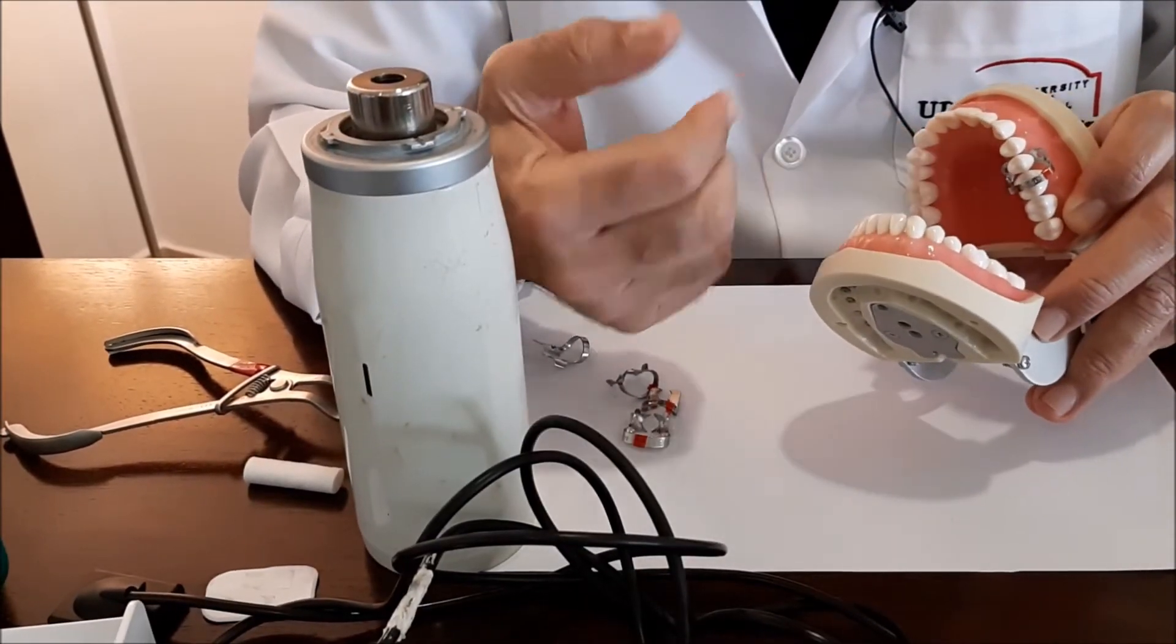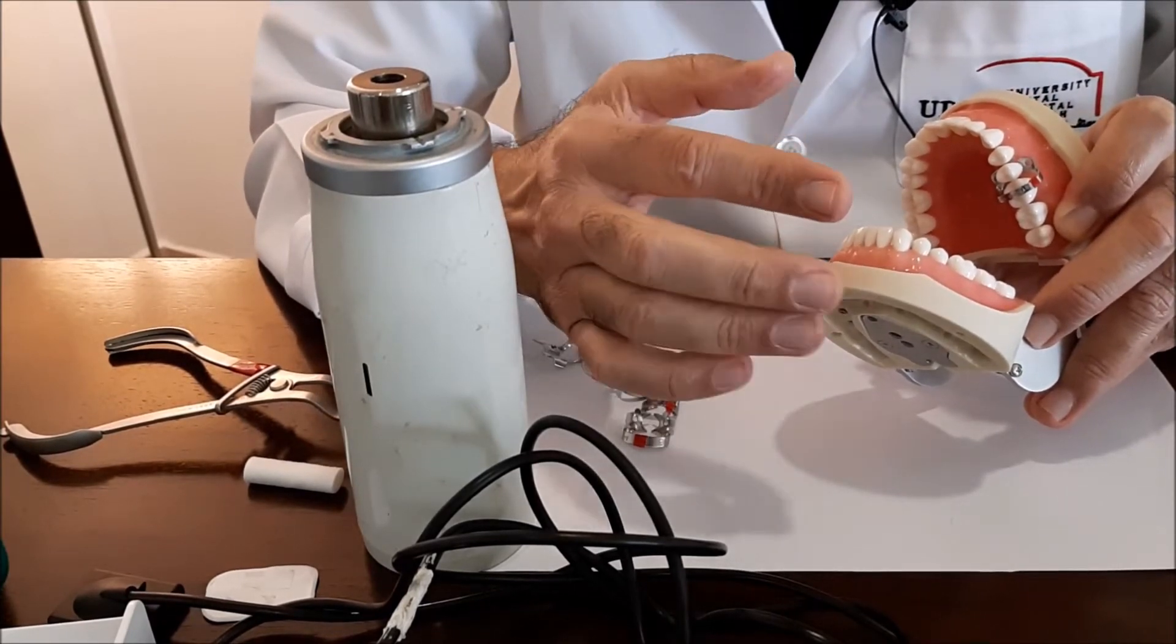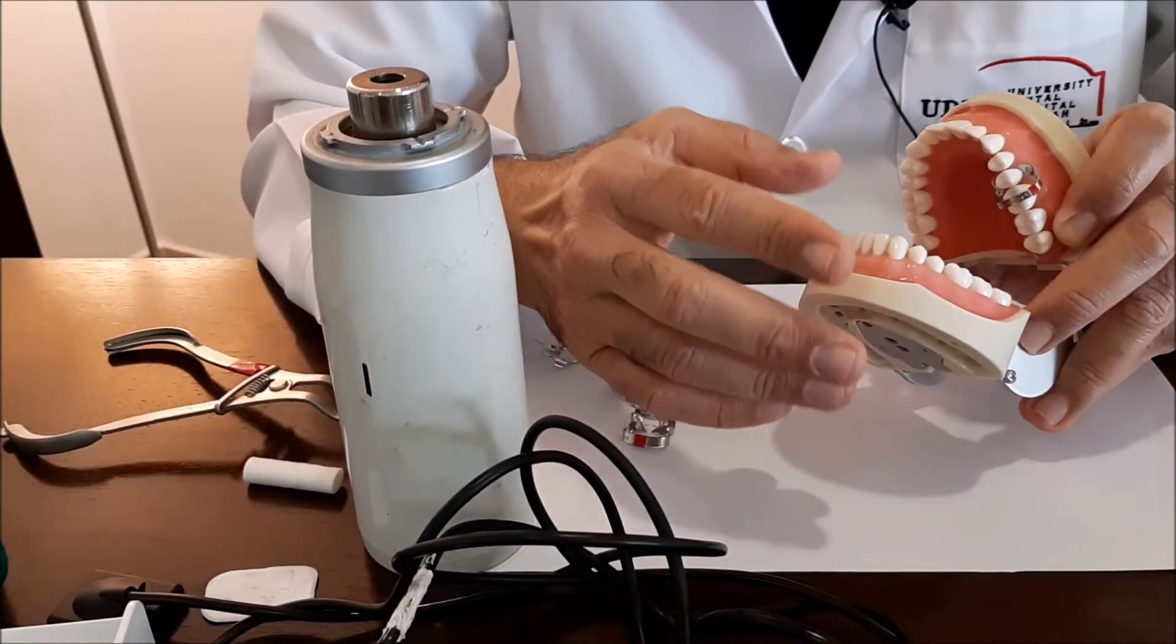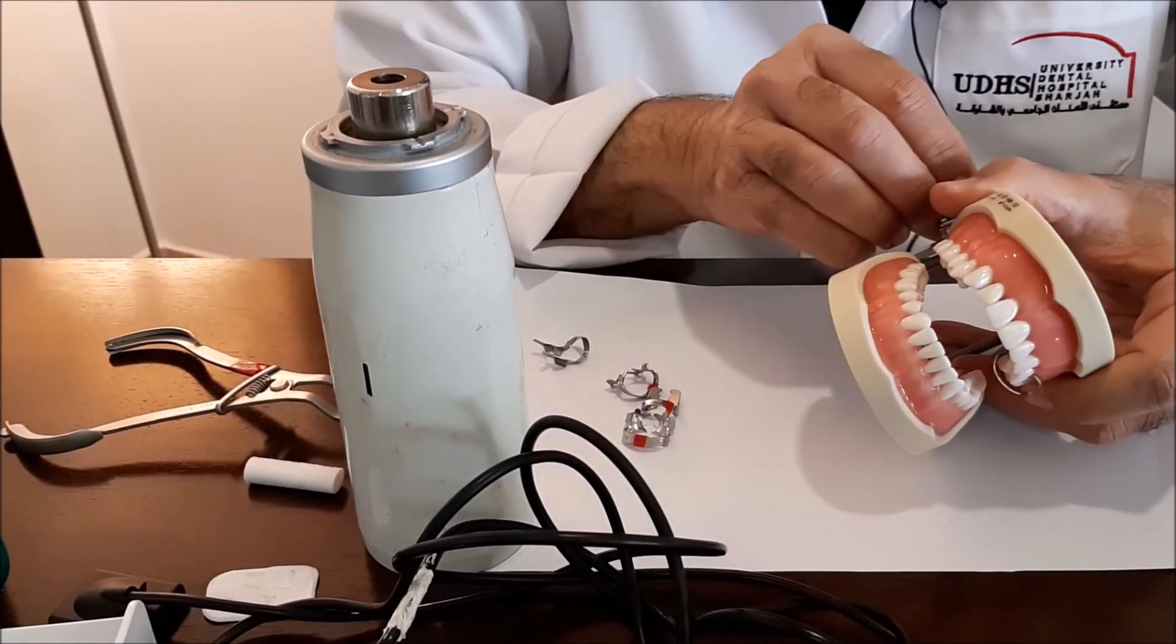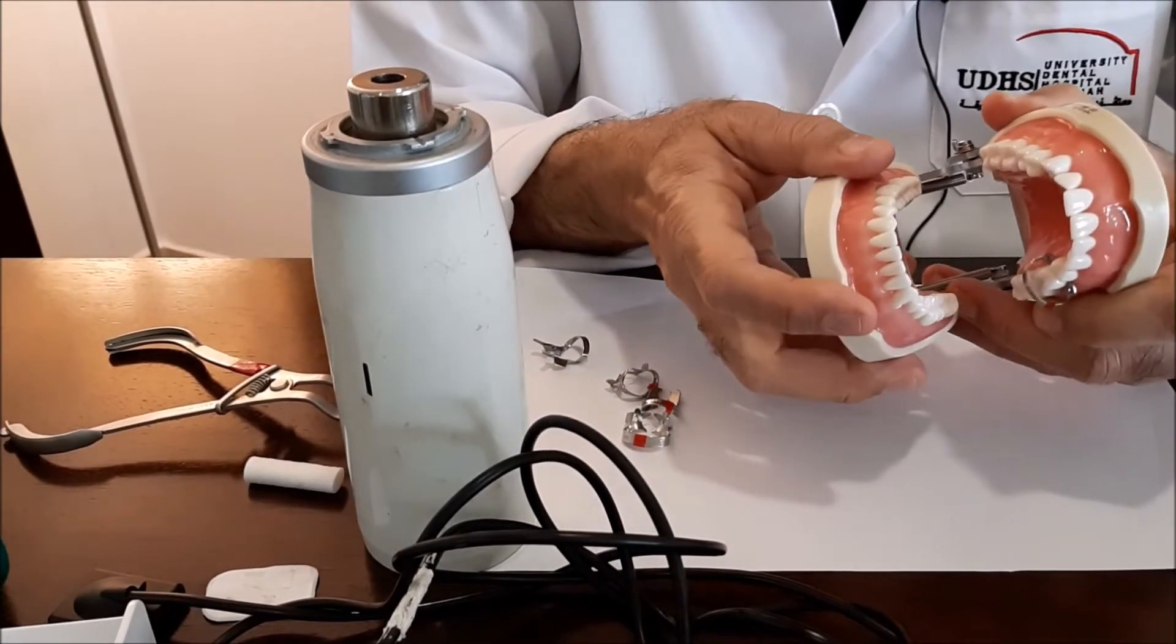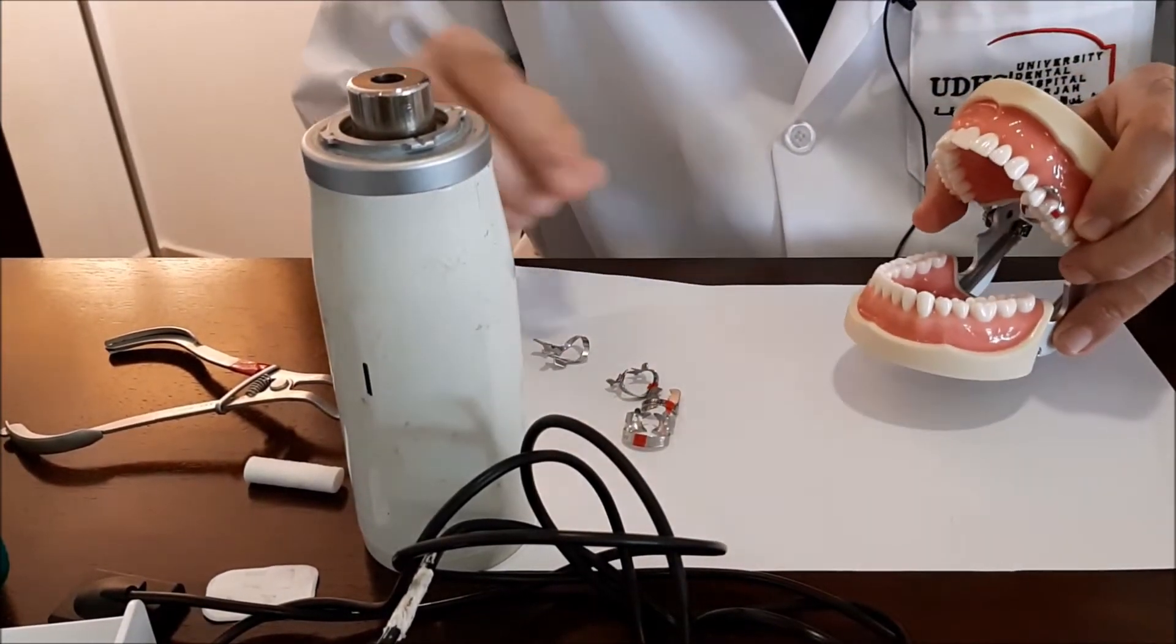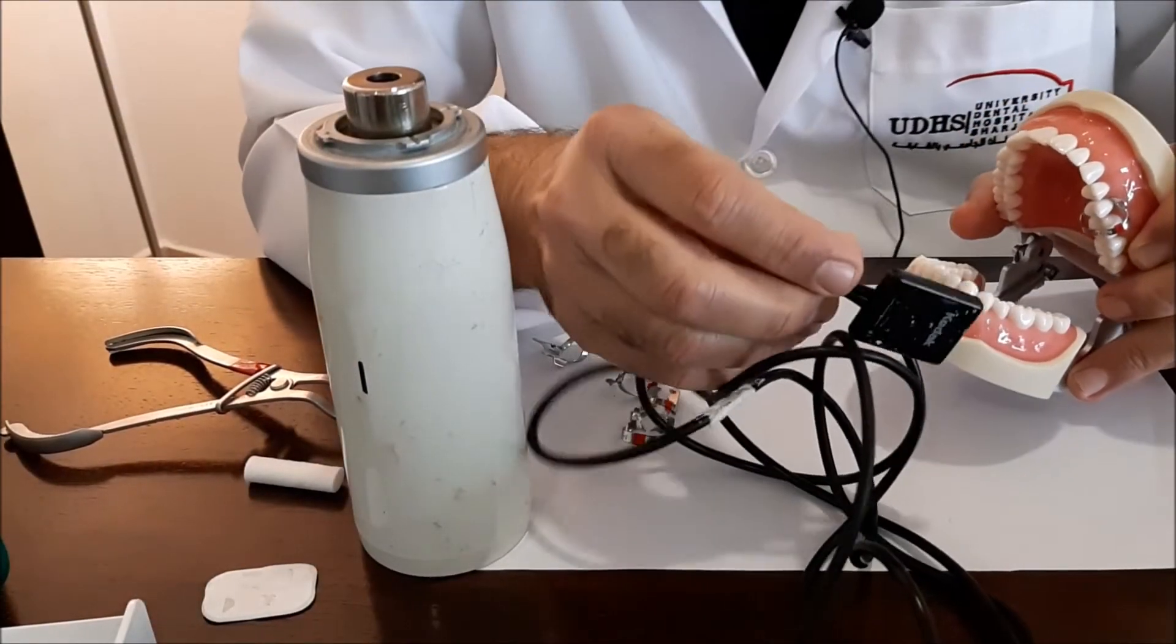There is no specific or uniform shape that can be applied to all shapes of the palates. However, we need to rethink about the positioning or understand what's the idea of positioning of the sensors when we are doing a radiograph for the premolars.